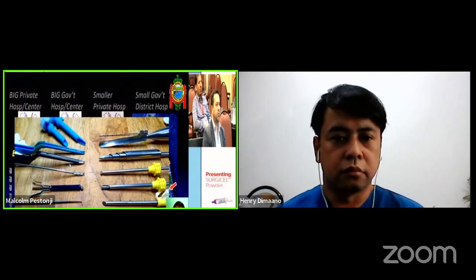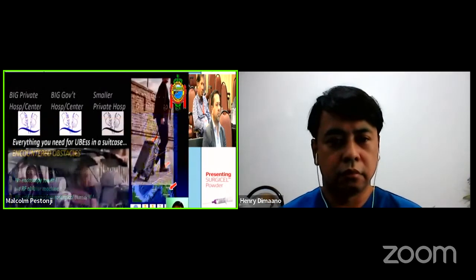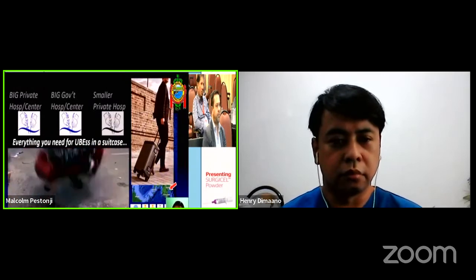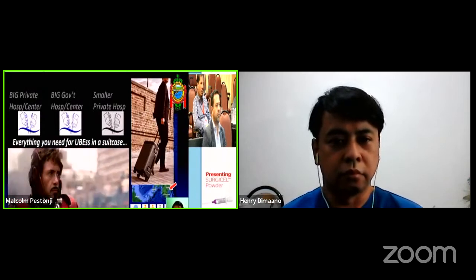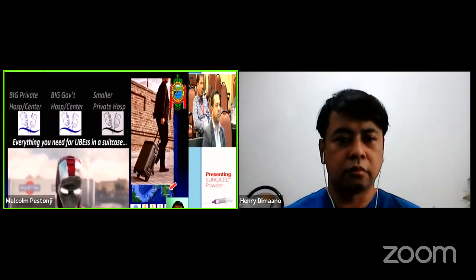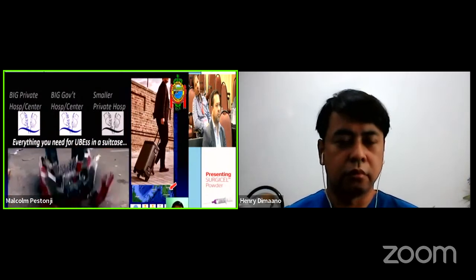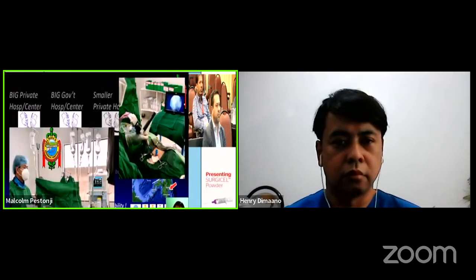And these are the instruments that I was showing you, modified bipolar probes, the burr tips that will fit the drill. And I would like to think of being able to bring all my equipment and put it all in a suitcase. That's what I basically do. I can travel to any hospital that has an operating room that works, and I can basically do the surgery in the hospital where I go. Okay, so this is basically our setup.